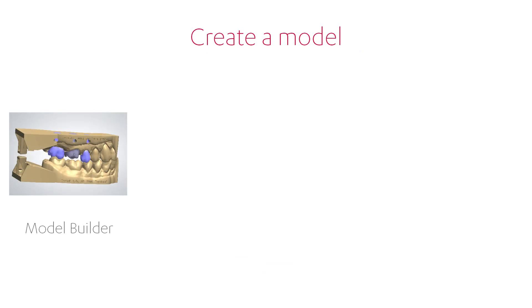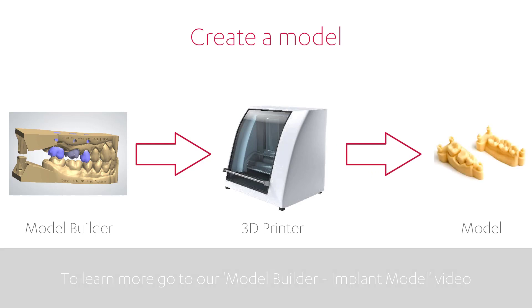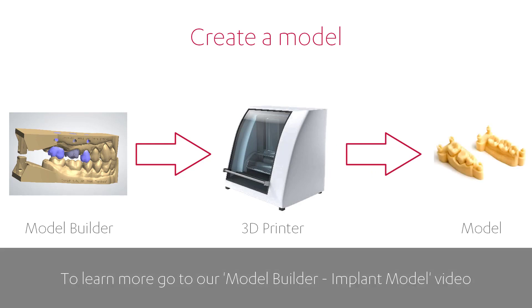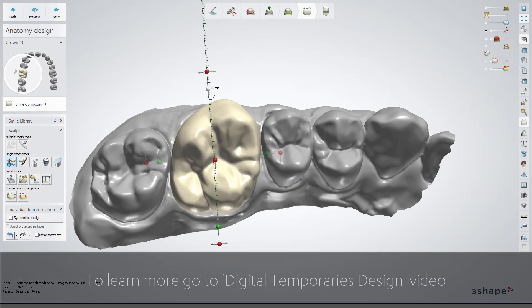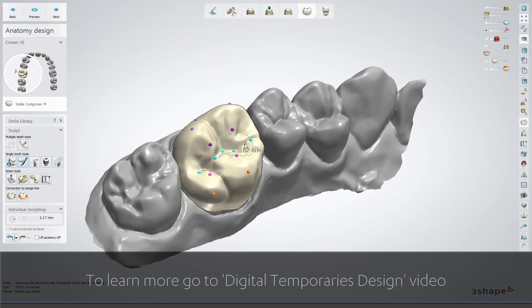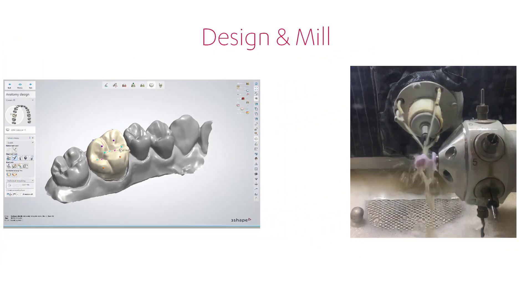The next step is to create a model of the case in 3Shape Model Builder, then print it in a 3D printer or create a PMMA model. Now you need to design the restoration for the sent case in the usual manner and after that, mill it.